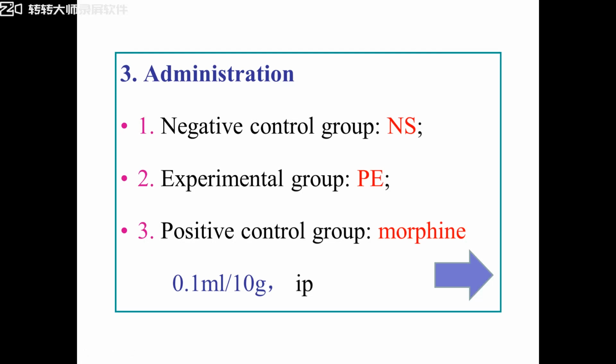During these 15 minutes, we can imagine. The first one, we injected normal saline. Normal saline doesn't have analgesic action, so the pain threshold may change from 10 to 11, 12, or change into 9, 8 seconds. And later we will know. In fact, we also know normal saline doesn't have analgesic action, though the pain threshold has changed. We can know it doesn't have analgesic action.